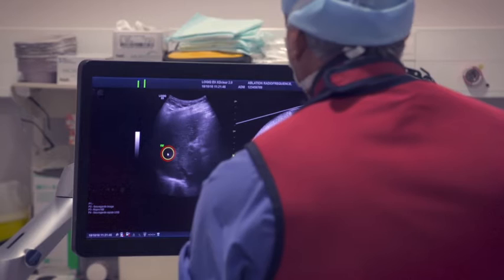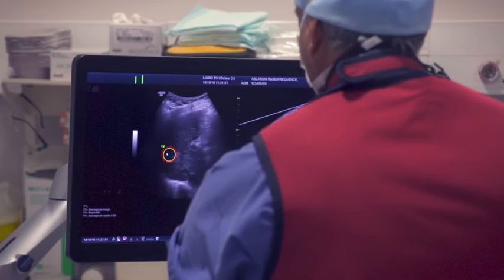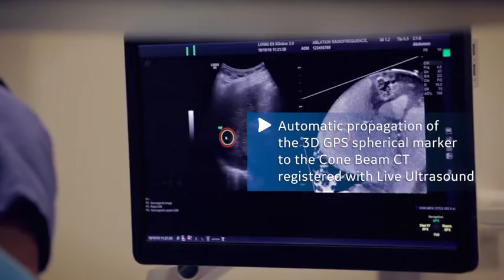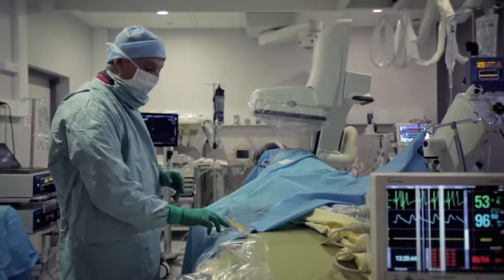As I did on the cone beam CT volume earlier, I do the same thing here. I place a 3D GPS marker — a sphere, a region of interest — using ultrasound, which will be automatically exported and propagated to the cone beam CT reference volume.